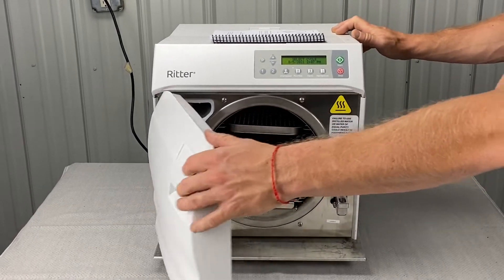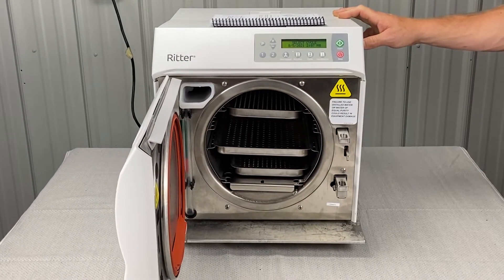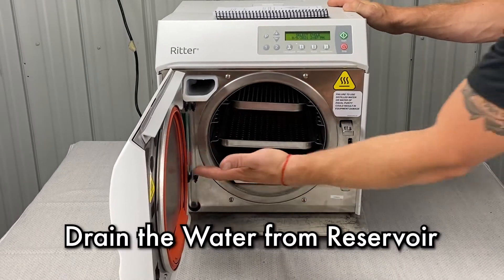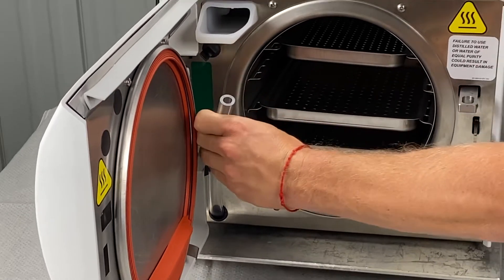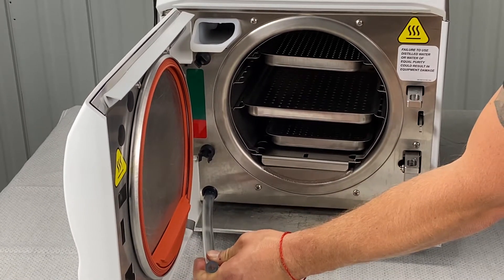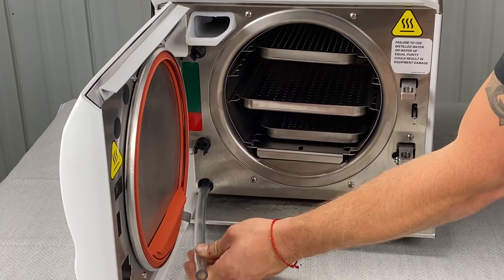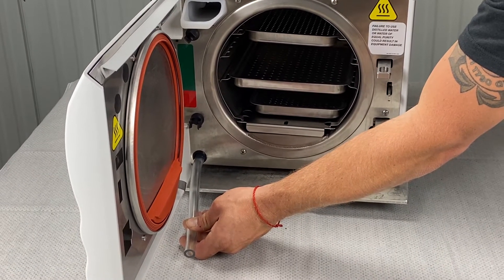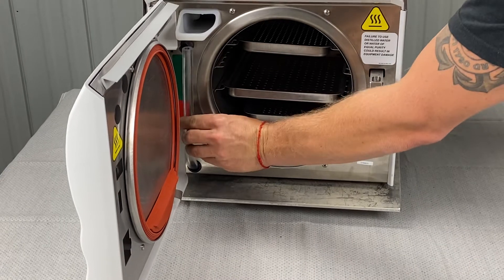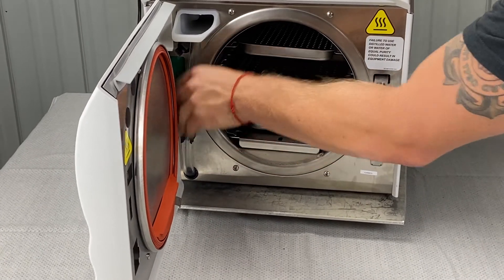My biggest pet peeve for anybody performing weekly maintenance is to drain the water weekly. We are empty right now, but basically you just take this tube, hold it down into a bucket, and just drain it until it comes out empty. The more often you do that, the better off everything and everyone will be.